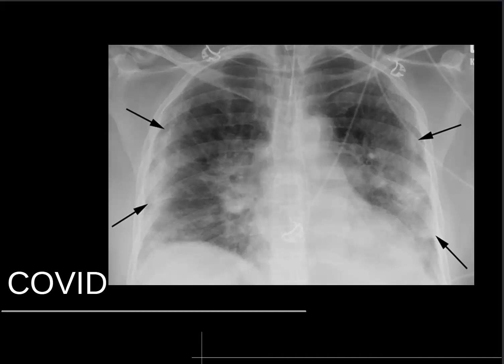I do feel that it's necessary to give a special mention to the chest x-ray when it came to the diagnosis of COVID. It was incredibly important, the chest x-ray during the pandemic, because we needed to diagnose COVID quickly, because we needed to treat these patients quickly, and we needed to isolate these patients as soon as we knew they had COVID.